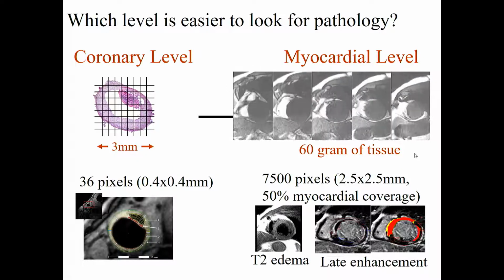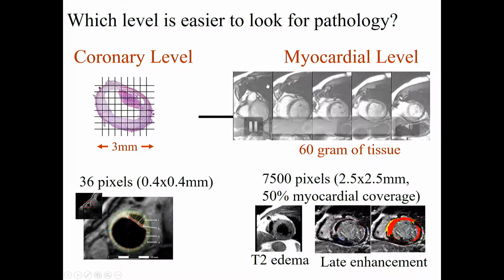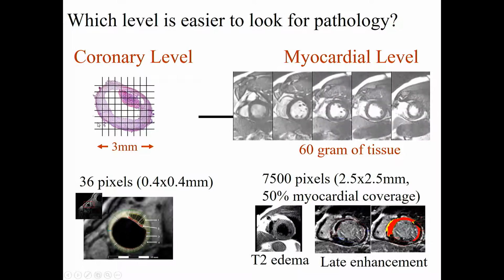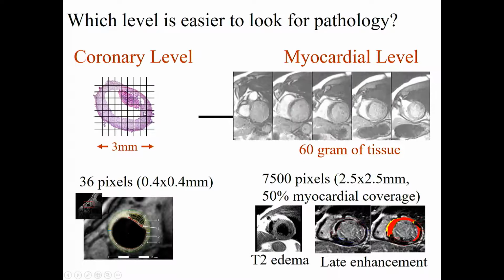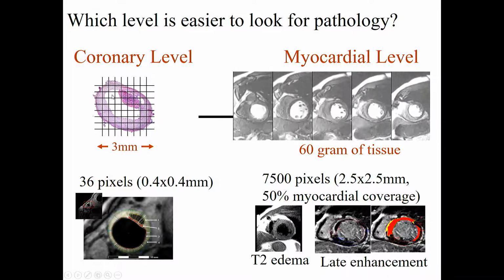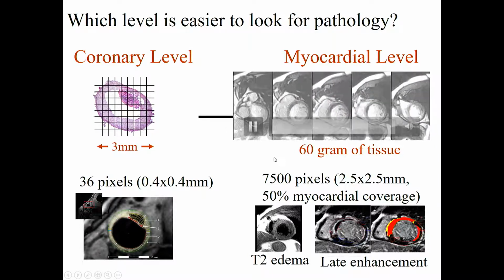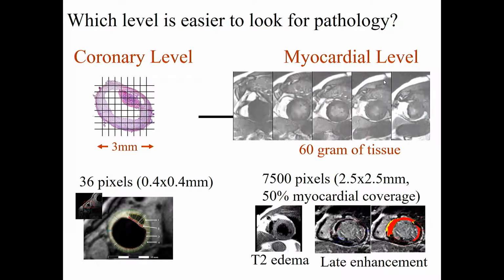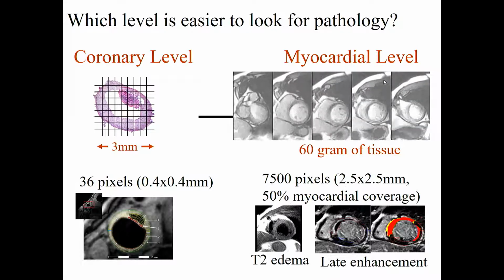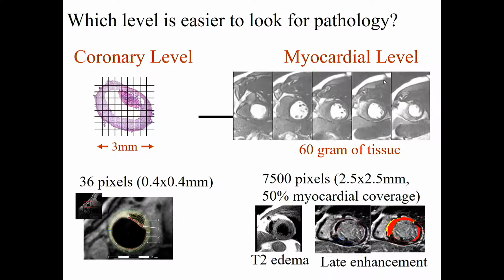MRI has a strength because it has a wealth of information from the myocardium, as I mentioned. So in a way, I think it is complementary to coronary luminal imaging techniques such as CT. For example, by assessing the amount of CT coronary stenosis, you can correlate how much myocardium is jeopardized and what the status of the myocardium is, as I mentioned, whether it's ischemic or non-viable. By that you can have a sort of complete picture of what therapy should be best guided by this information.